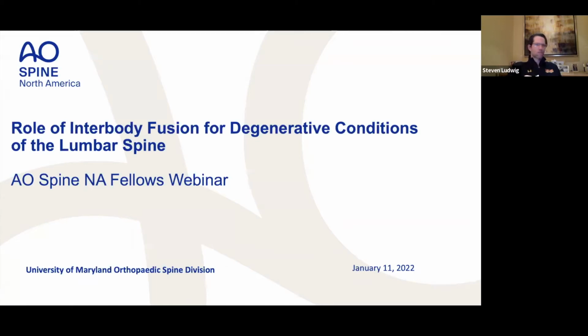Now, over the past 10 to 15 years of doing spine surgery, as you're going to learn, there's been an onslaught of different approaches for the treatment of degenerative conditions and disorders of the spine. And obviously these include the role for an interbody device. When we think about interbody devices at Maryland, and most of you should go through this thinking process, is the role for interbody to enhance the fusion? Is the role of the interbody to enhance the decompression or do an indirect decompression? Is the role of the interbody to help with deformity correction, or for all of them?